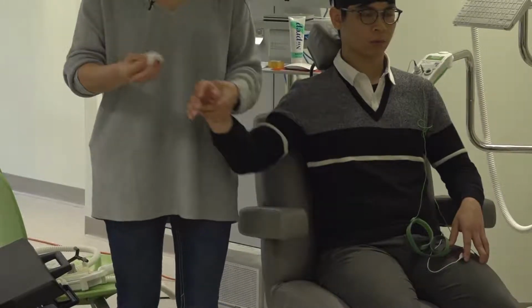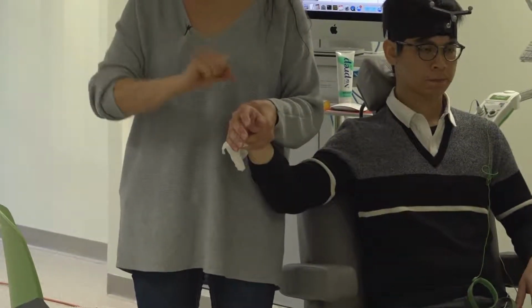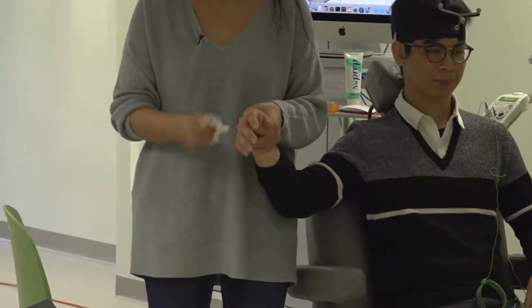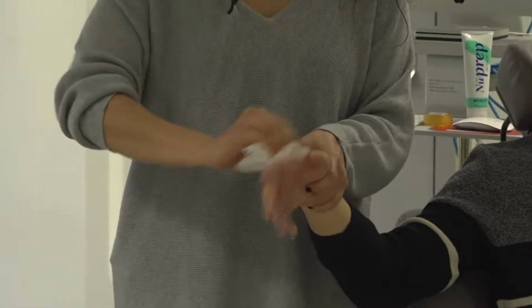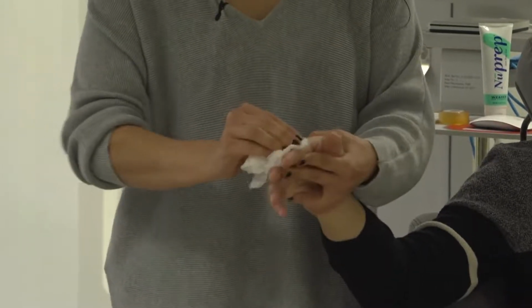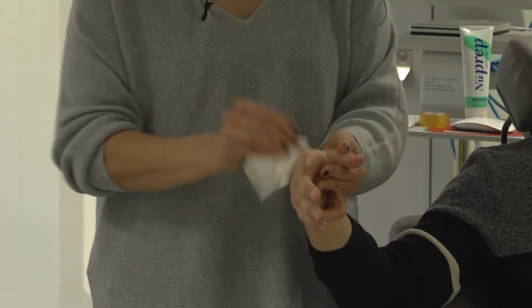It's really dirty, so you really want to clean the area very, very well. And what we were doing was with a brush, cleaning the area. It was great. We really got really nice results, and it was really clean, and so I highly recommend it. And clean the area well.